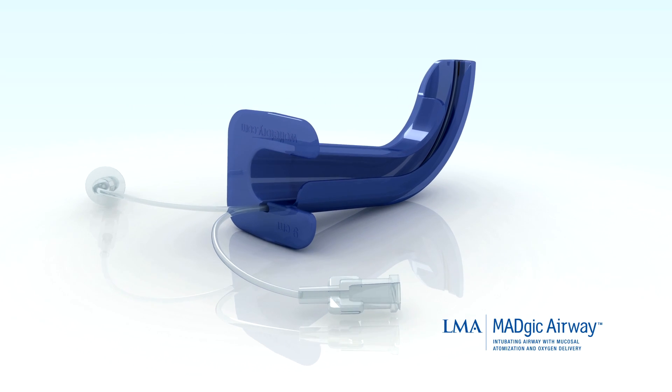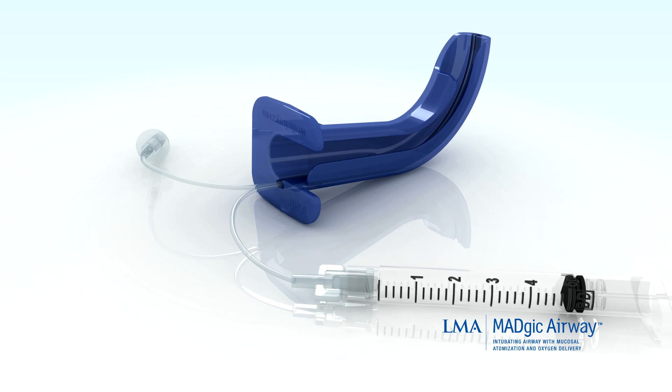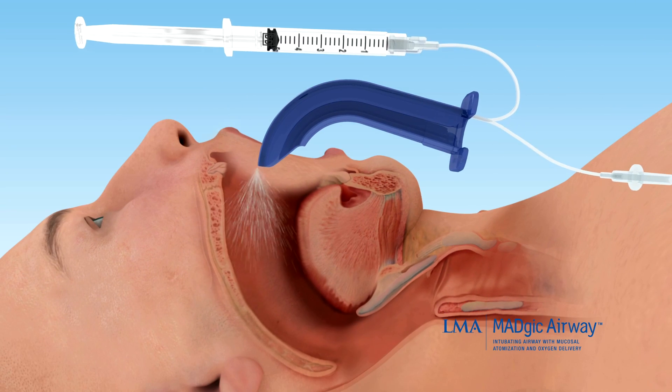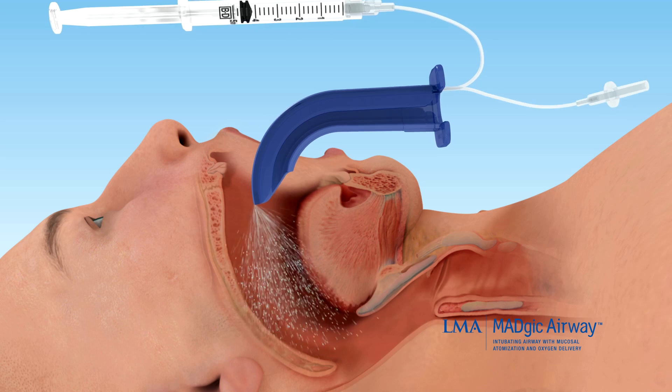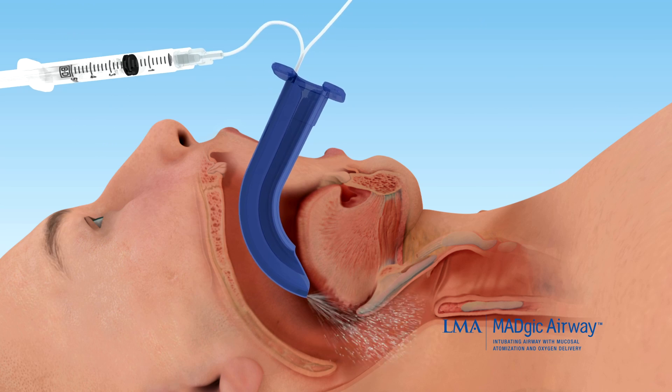To use the Magic Airway, first draw up topical anesthetic into the luer-lock syringe. Attach the syringe to the port. Apply topical anesthetic to the mouth and oropharynx by compressing the syringe while directing the distal end of the Magic Airway towards the tongue, palate, and posterior pharynx.